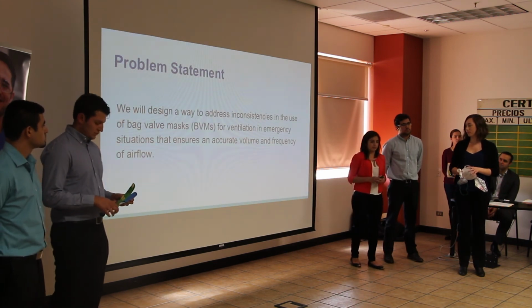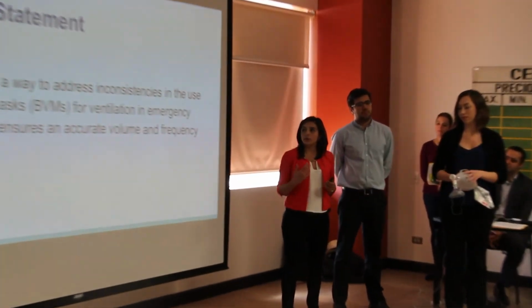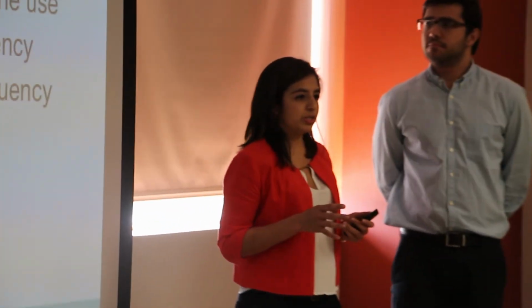Like focusing in the problem statement, we decided that we will design a way to address the inconsistencies of the bag valve mask used in the emergency situations that paramedics attend. So they have some inconsistencies in what the volume and frequency are. So we want to ensure the accurate volume and frequency of airflow that the bag valve mask is given to the patient.